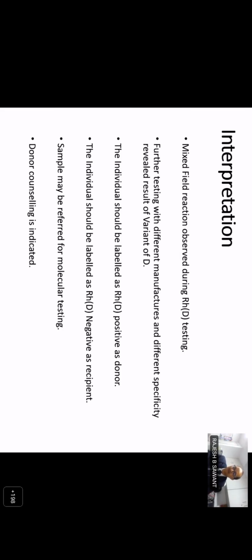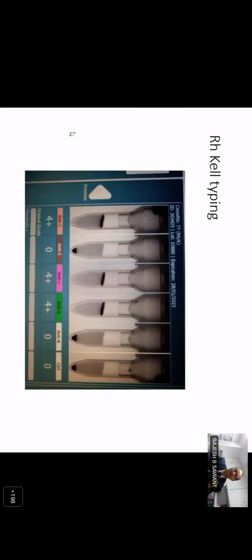This is very important in patients who are likely to be multiply transfused, for example, thalassemia individuals. Once you know their phenotype, what the blood centers do now, because most of them are also doing the phenotype of their donors, is this: suppose you have a patient who is negative for E antigen. Then it is better to proactively transfuse only E antigen negative blood to this patient, so that this individual does not get exposed to any E antigen and does not form an anti-E antibody.